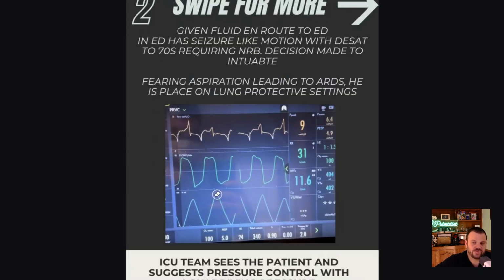I think what they're doing essentially here is panting on the ventilator, just breathing in and out very, very fast. They're not going to be able to do that forever. They're going to build up auto PEEP. It's going to be harder to breathe. They're going to get more agitated. They're going to get more drug, et cetera, et cetera.